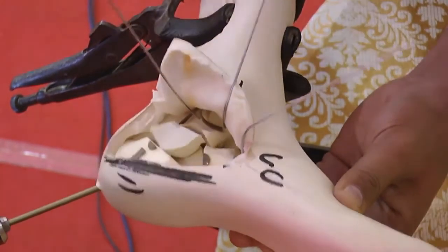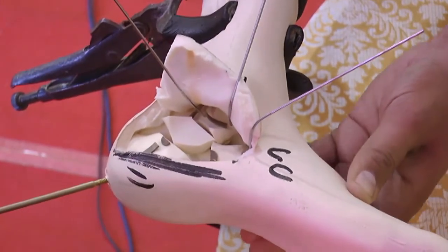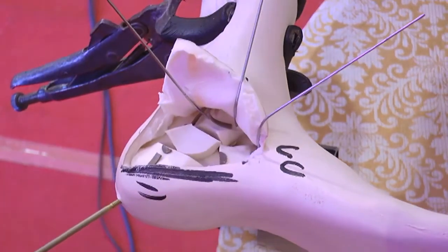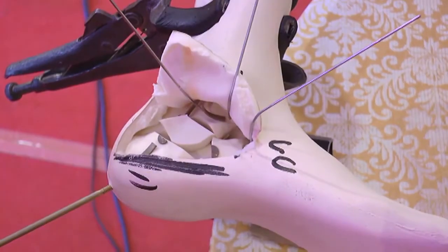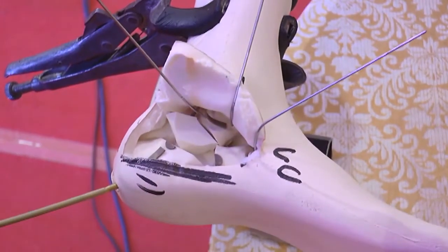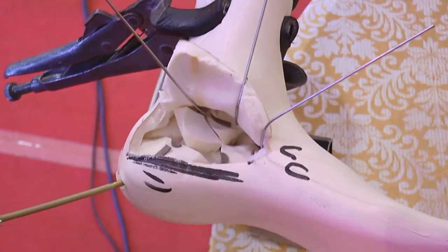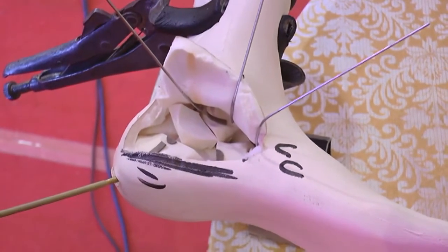When you have reached the fracture in the axial view, then you have to manipulate the tuberosity in two maneuvers. One is bringing the tuberosity down, because of the impaction, the tuberosity is also tilted, and the inclination angle is less. So you have to bring the tuberosity down with this maneuver and lift up your hand to take it out of varus. And in this position, you can replace your drill bit and use a T handle here.